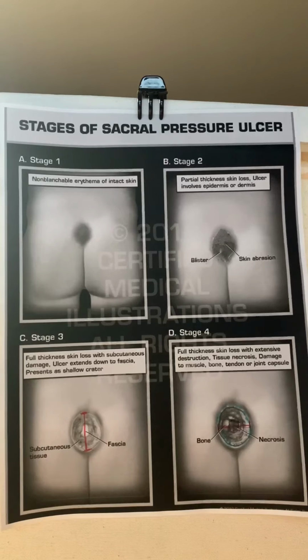The computerized segmentation of the wound measurement characterizes the wounds. It detects the granulation, the slough, and eschar tissue. This uses a color camera that can detect between the three if there is one of those present.